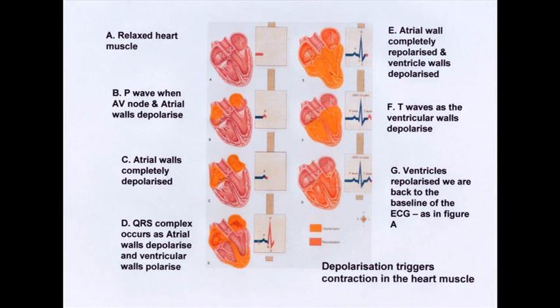What is measured or can be detected on the ECG? The underlying rate and rhythm mechanism of the heart, the orientation of the heart or how it is placed in the chest cavity, evidence of increased thickness, hypertrophy of the heart muscle, evidence of damage to the various parts of the heart muscle, evidence of acutely impaired blood flow to the heart muscle, and patterns of abnormal electrical activity that may predispose the patient to an abnormal cardiac rhythm or other disturbances.